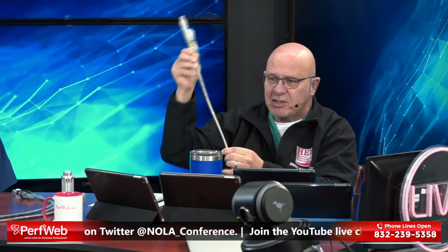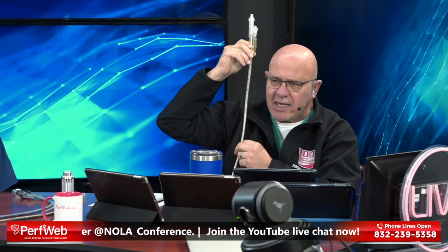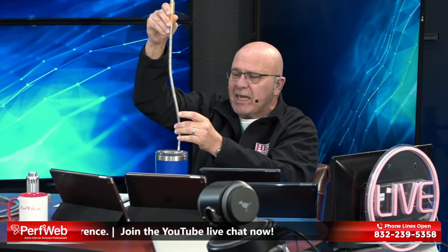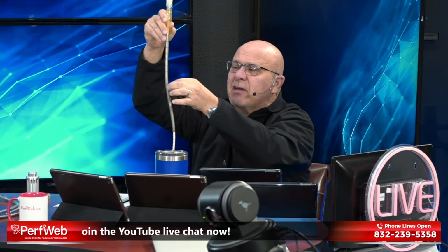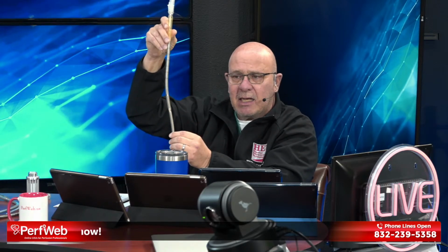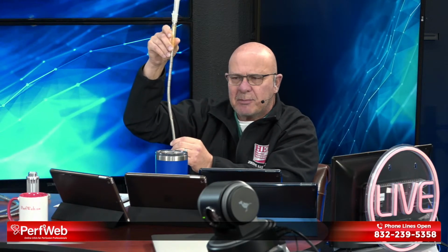This is an Avalon catheter. They have another called a Crescent. It is very similar. It is a dual lumen, single catheter VV ECMO. So this goes into the right IJ. The tip goes into the inferior vena cava. It has drainage from the inferior vena cava and the superior vena cava with a return in the right atrium. And this can be finicky in positioning, so you have to be aware of that.